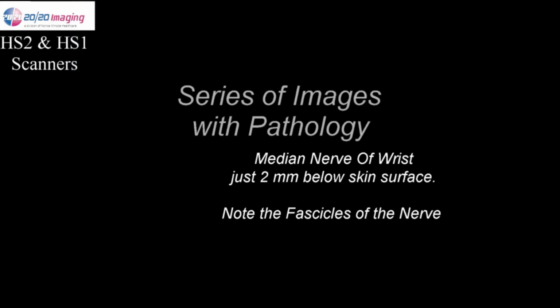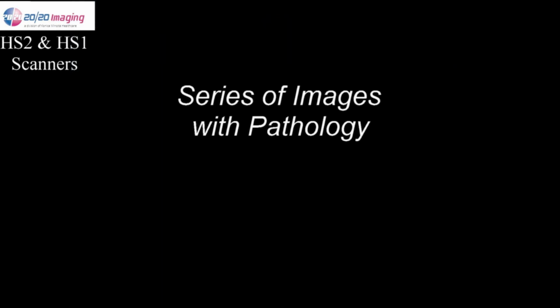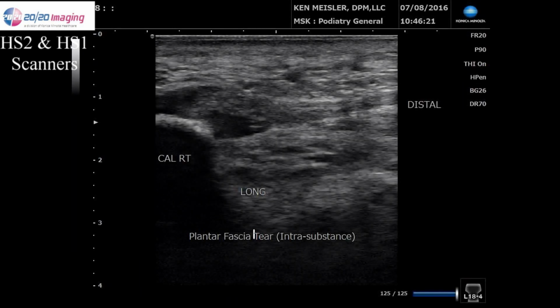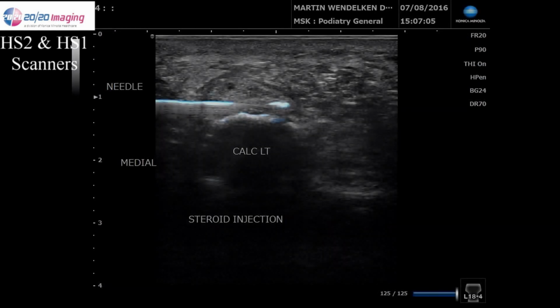You've now seen normal things. Let's look at some pathology. I'm going to run through this very quickly. First, let's start with a thickened plantar fascia, 5.5 millimeters. Next, let's look at a plantar fascia tear. You can see that anechoic area right at the calcaneus is a partial tear.